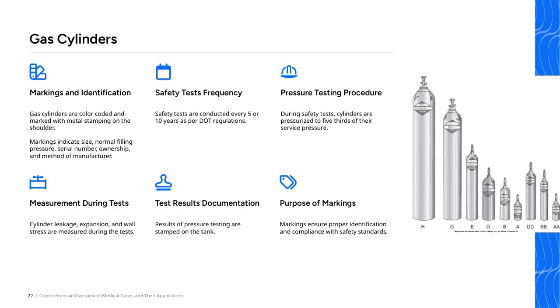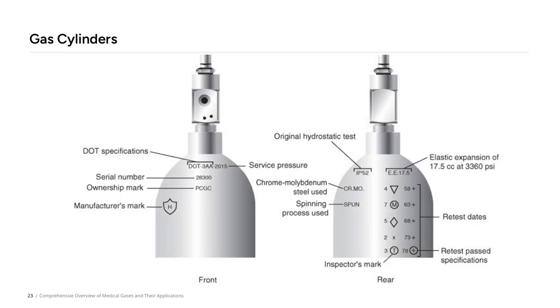Let's now take a closer look at gas cylinders, which are fundamental components in the storage and delivery of medical gases. These cylinders are designed to safely contain gases under high pressure, ensuring that they can be used reliably and securely in various healthcare settings.